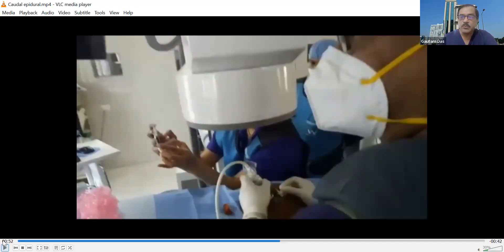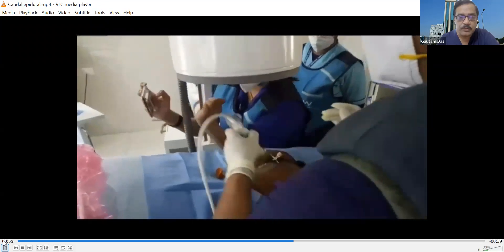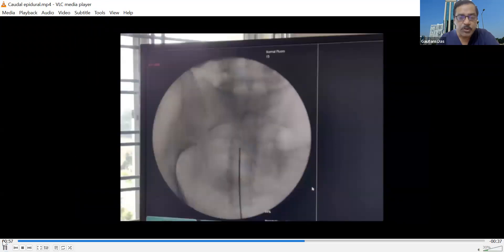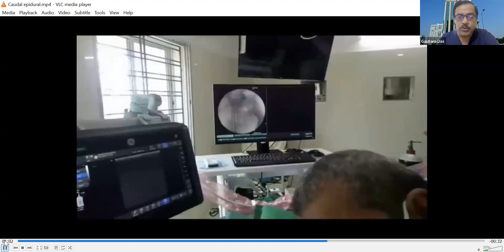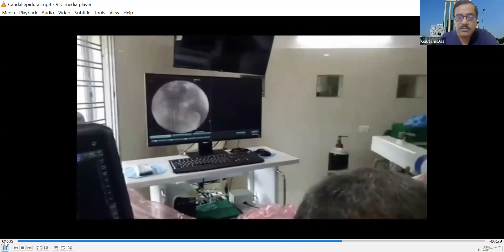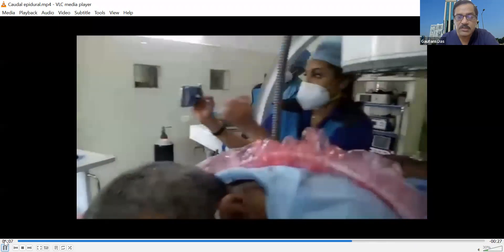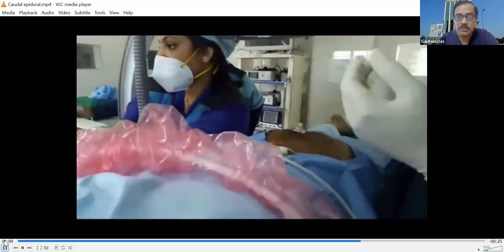At this stage, we must be checking the distribution of the dye. We can introduce the needle further under fluoroscopy (CM) guidance and inject dye. We have introduced the needle under fluoroscopy guidance and are at the level of sacral three. Before giving the particulate steroid injection, we must give a dye injection to confirm it is not intravascular or intrathecal.